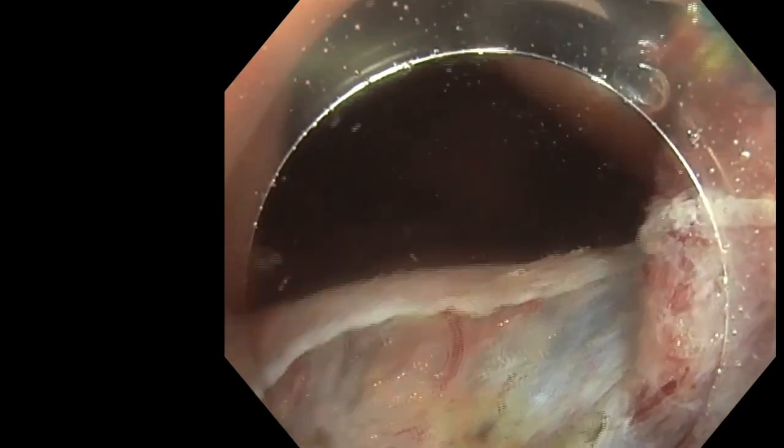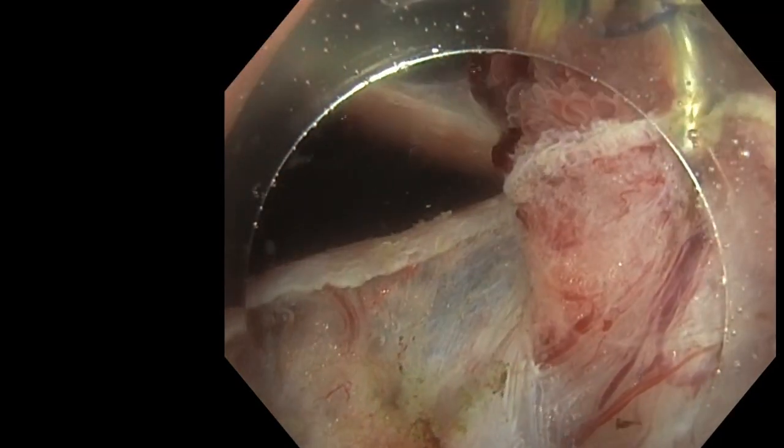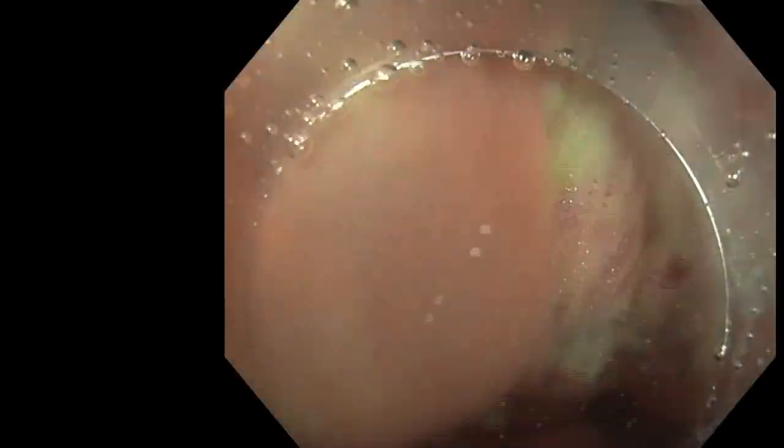And you will see at the end there is something at the bottom of the diverticula. It's not really a perforation. You have a tissue which is not muscle or only the longitudinal one, but there is a space. It's not totally open.